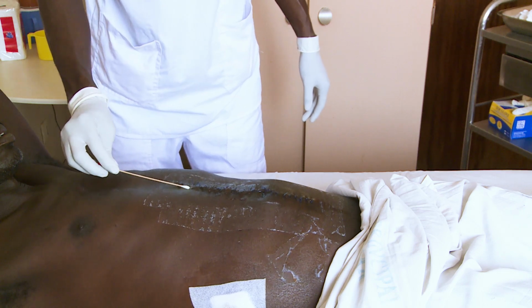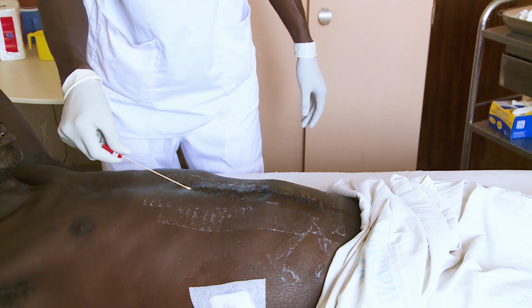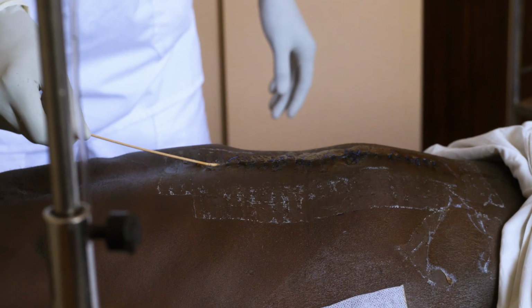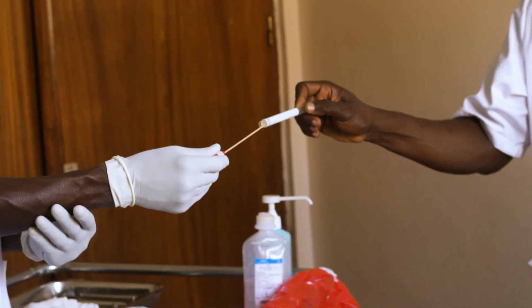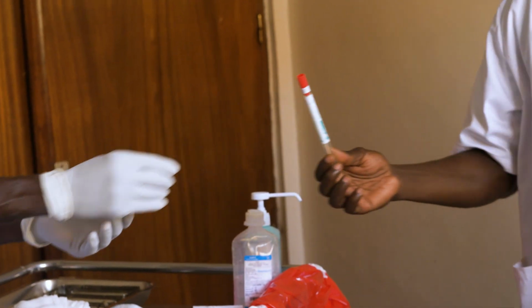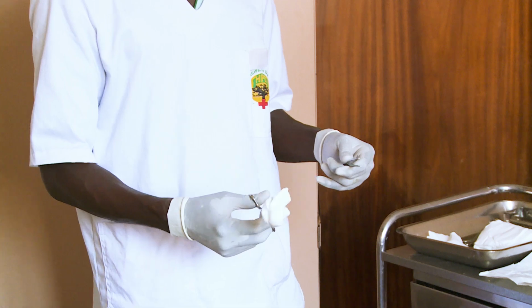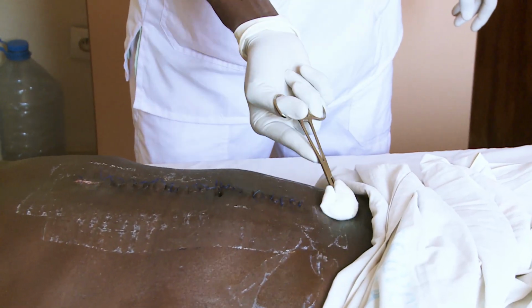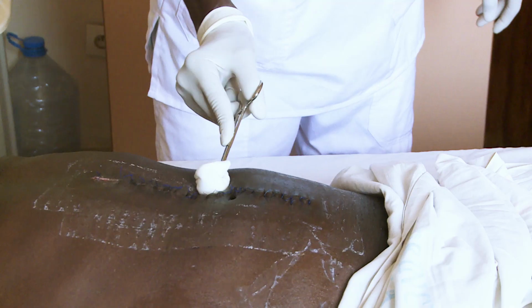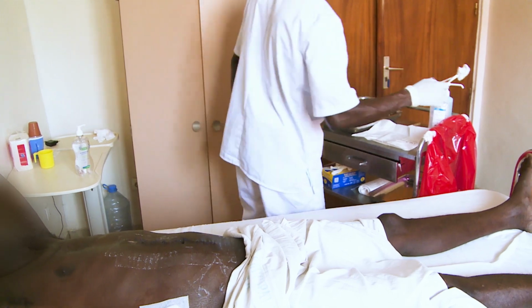Using the cotton tip swab from inside the specimen bottle, carefully swab the fluid by going as deep as possible into the purulent wound. Cautiously place the tipped swab inside the specimen container and seal tightly. If there is enough fluid leaking from the wound, preferably use a clean, dedicated pot for its collection. Once the sample has been collected, proceed with routine wound cleaning following the same procedure.